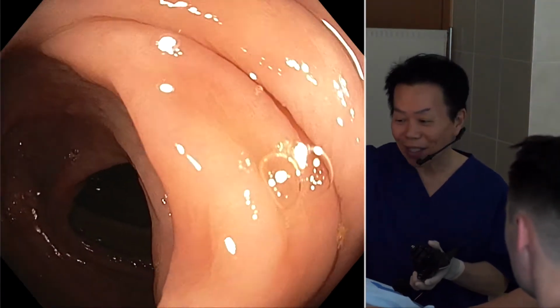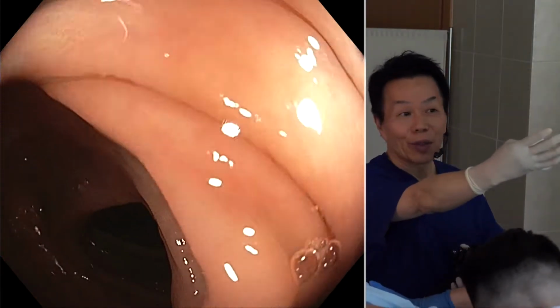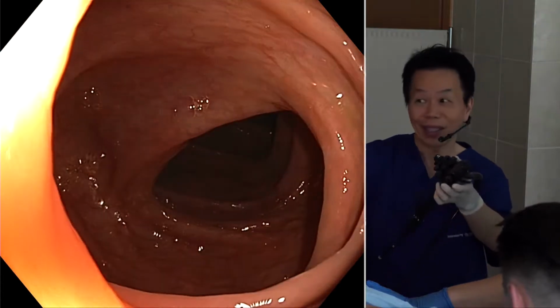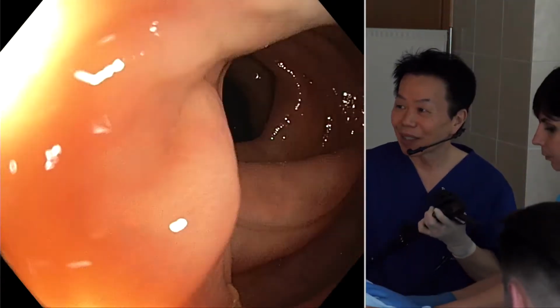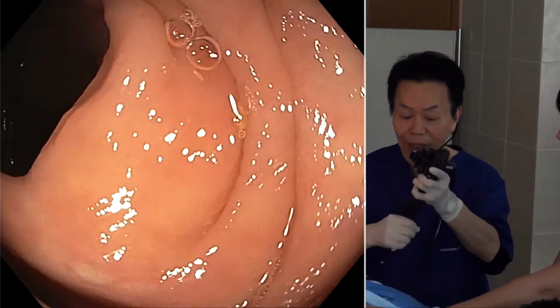Now I see. The trolley is on the opposite side, so it's a little bit complicated for me. I usually have the trolley in front of me, but now you can see some part of the scope is twisted and lying over the patient. So it can be a little bit difficult situation. And now I'm going to stiffen the scope.